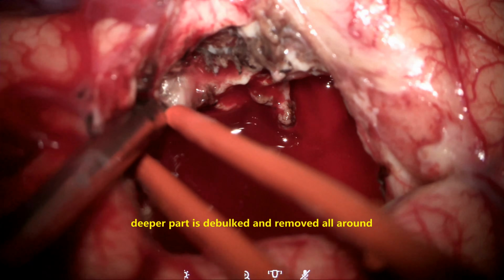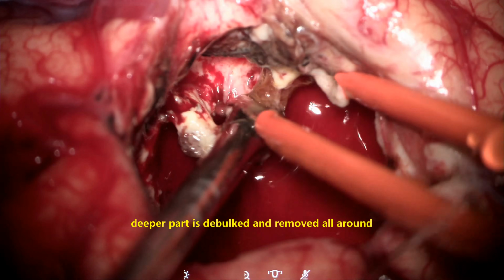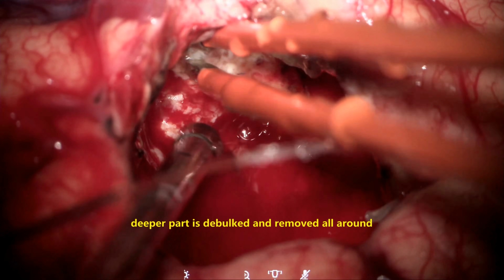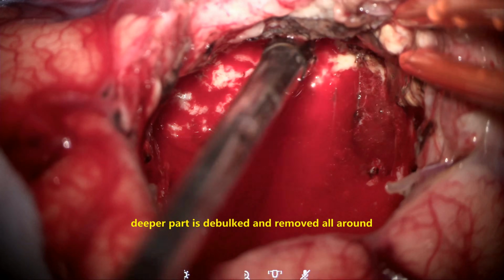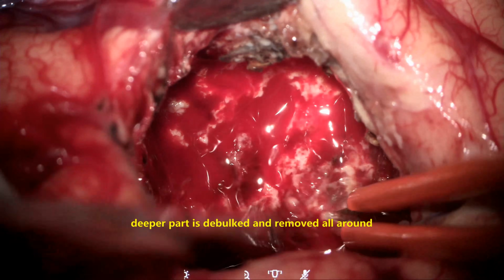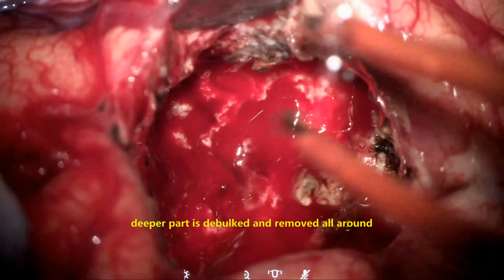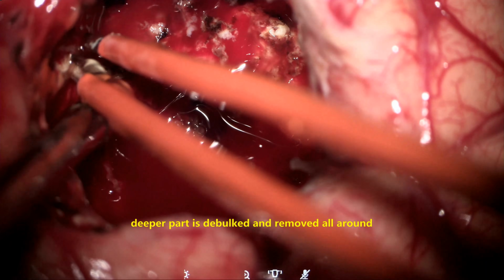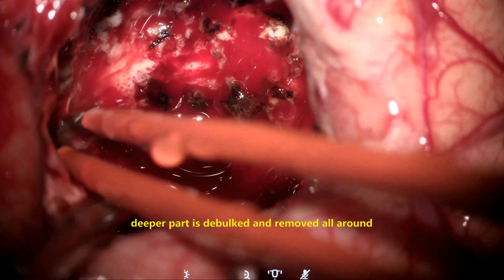Always remain in the center of the tumor and go to the periphery. Identify the color difference between the tumor and the normal brain, and the suckability of the pathology. Usually gliomas, tumors, metastases or lymphomas come easily into the suction. The normal brain doesn't come into the suction. The suction and bipolar should be kept low so that we don't inadvertently damage the surrounding normal brain with forceful suction.